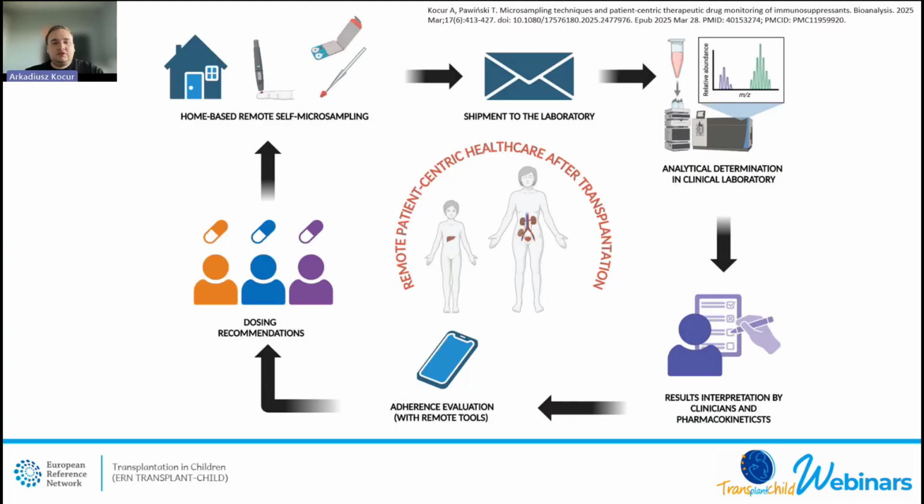And I would like to show the total implementation of microsampling. The home-based remote self-microsampling will be collected by patients under supervision of caregivers and shipped to the laboratory. We perform the analysis.